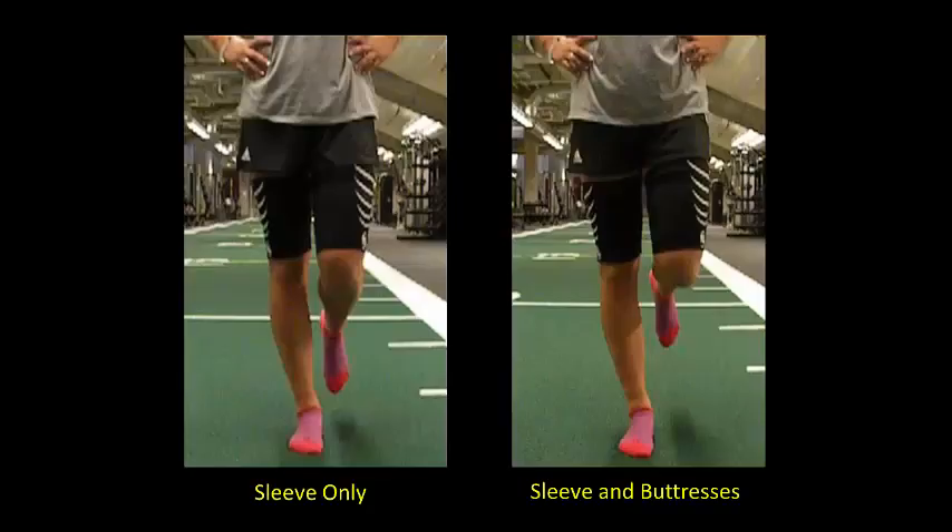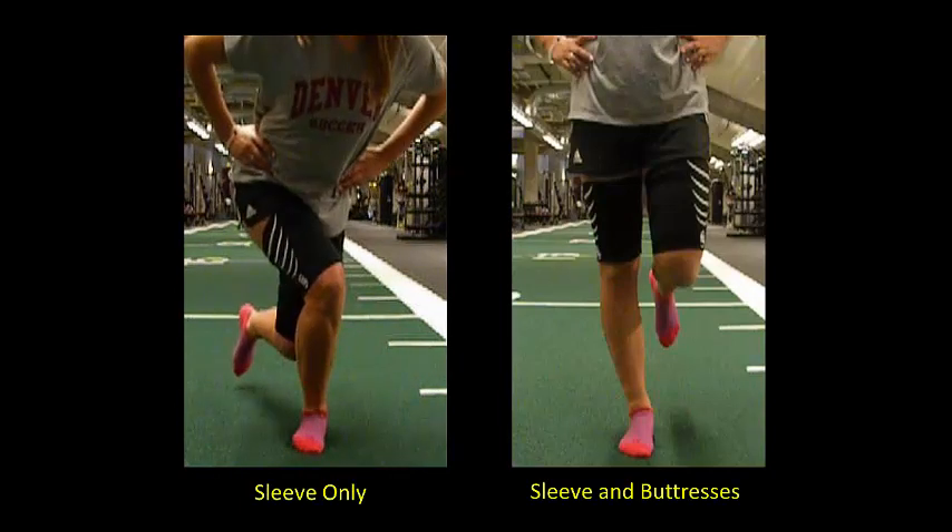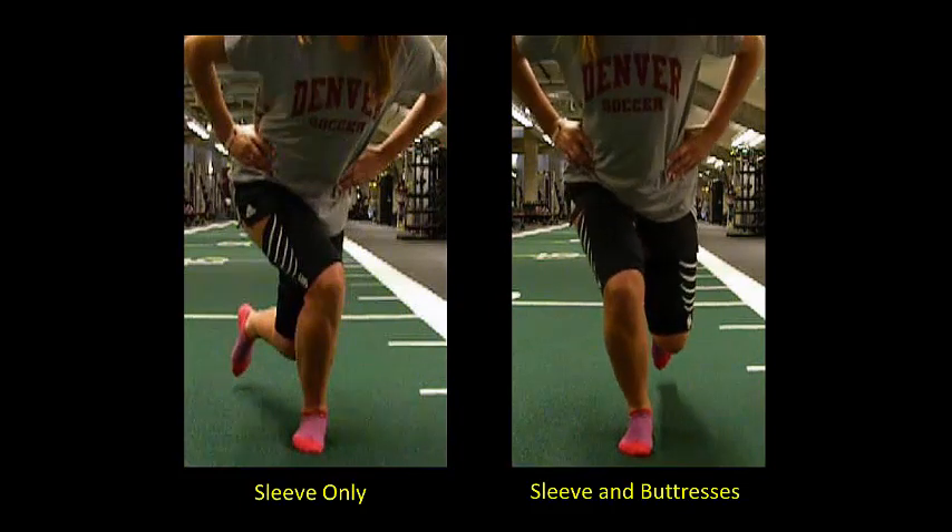The video on the left is a front view of a single leg squat performed with the sleeve only, and the video on the right is of the same athlete performing the squat with the sleeve and buttresses after walking a short distance.